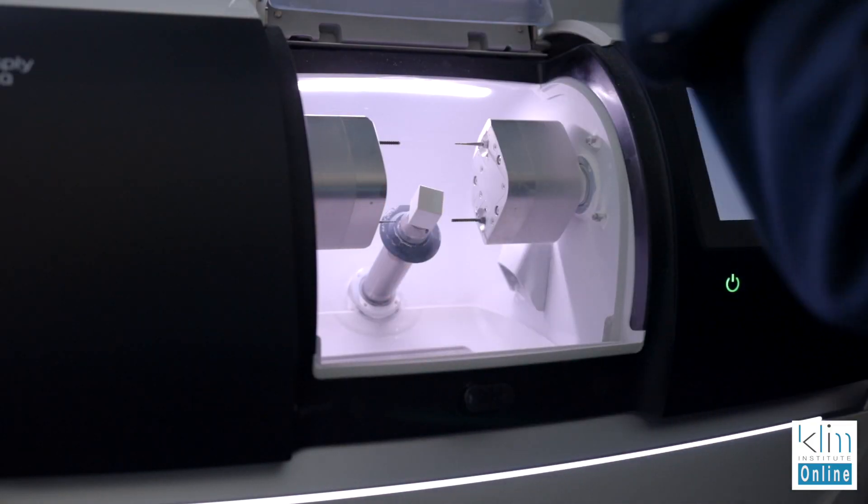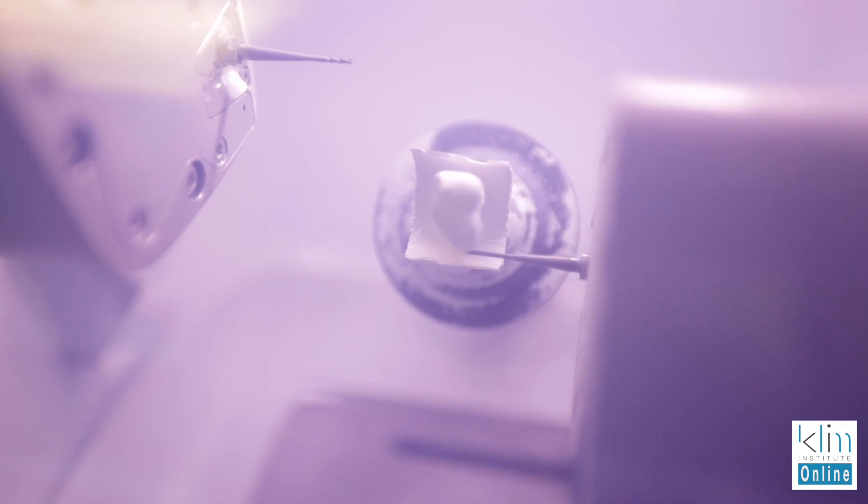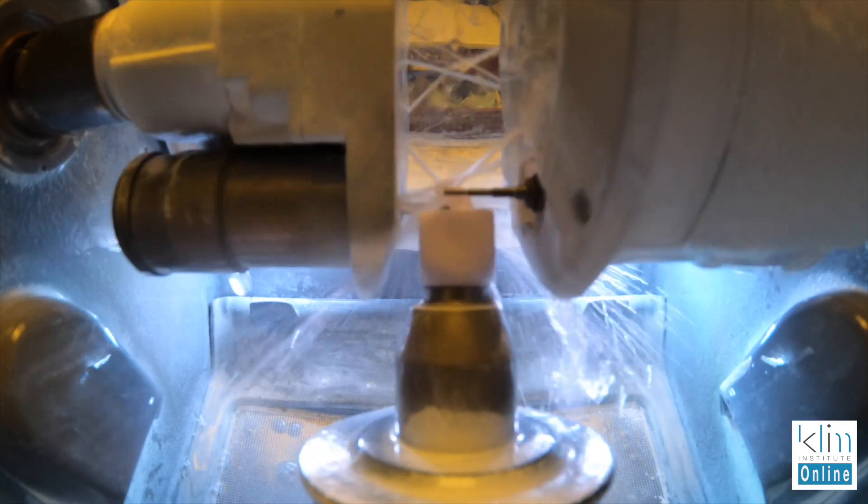What I have found with Emax is that even with PrimeMill — which I use mainly for Zirconia, it's the Zirconia beast — I use my MCXL for ceramics. But I do find that I don't like that microchipping at the margin. It's just the behavior of how you mill it in the intermediate state of the Emax.